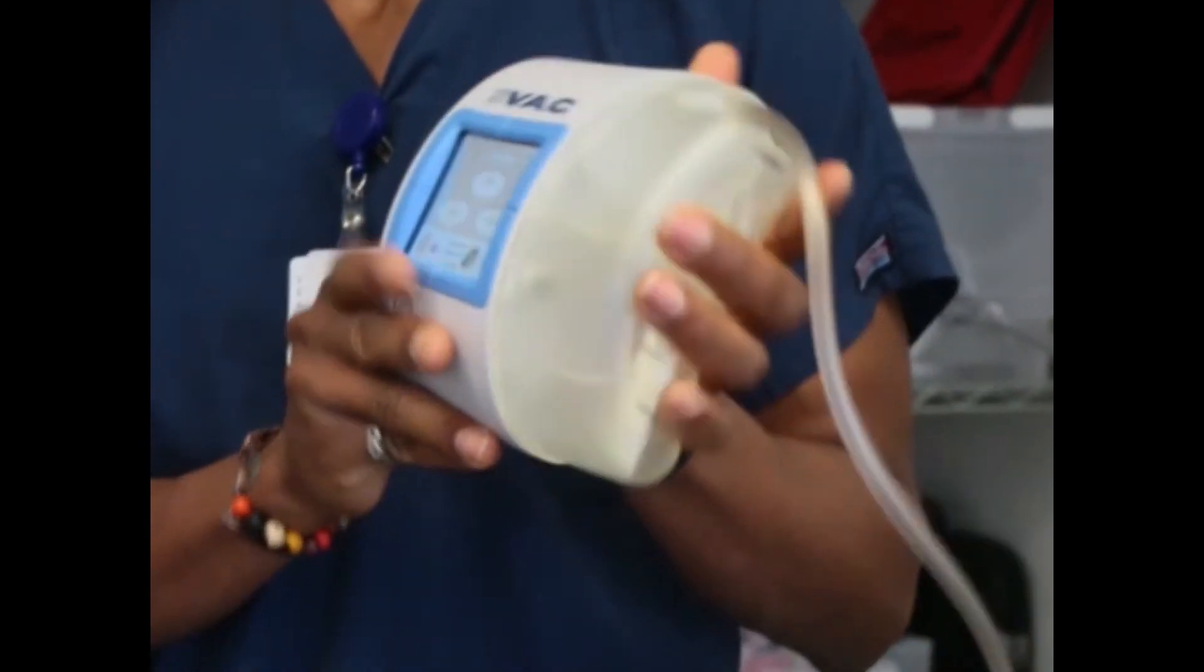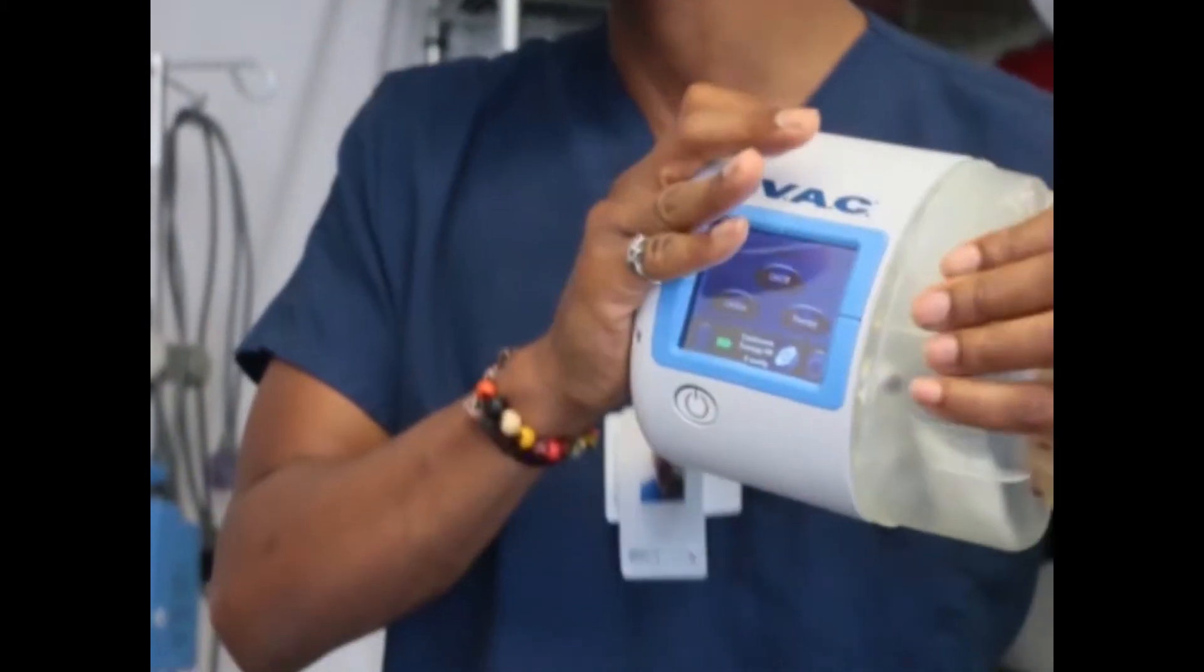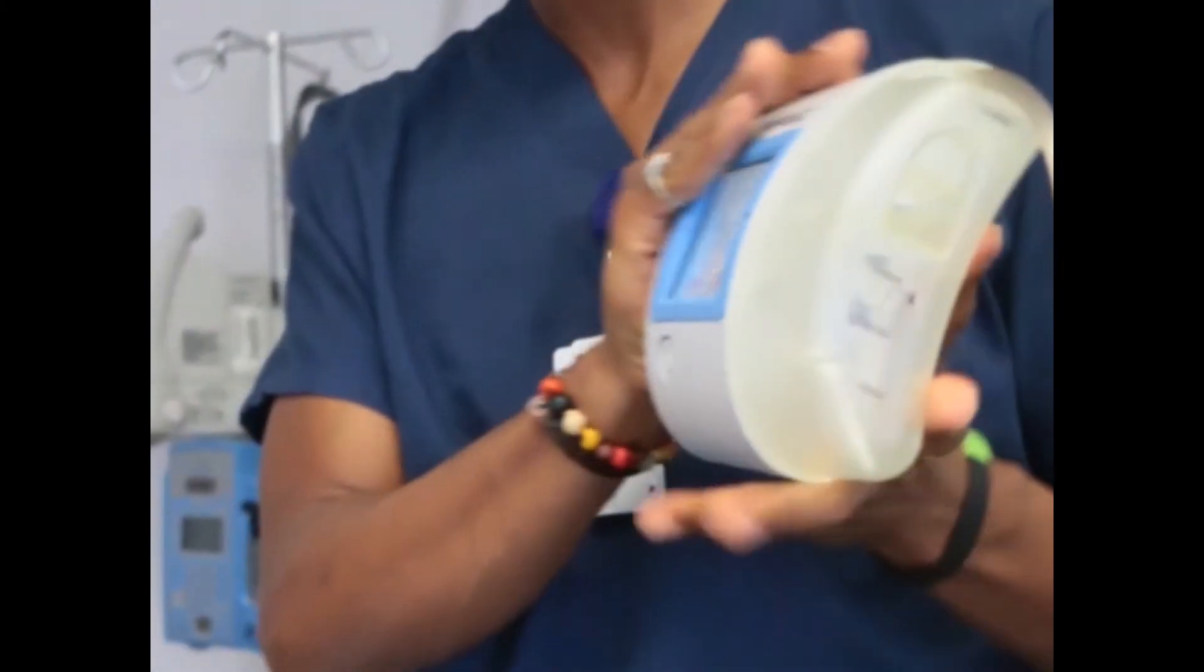The clicks are also weak. Yeah. Yeah, I kept, I was playing with it last night. I was like, did I hear it? Did I hear it? I would just pull back on it to make sure it was in solidly. Okay.